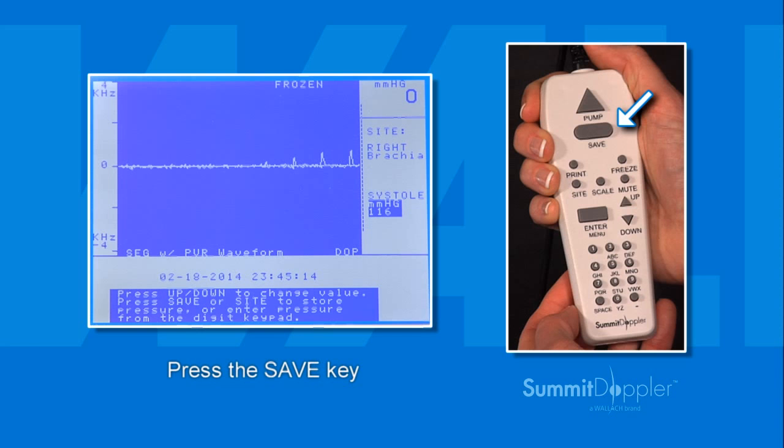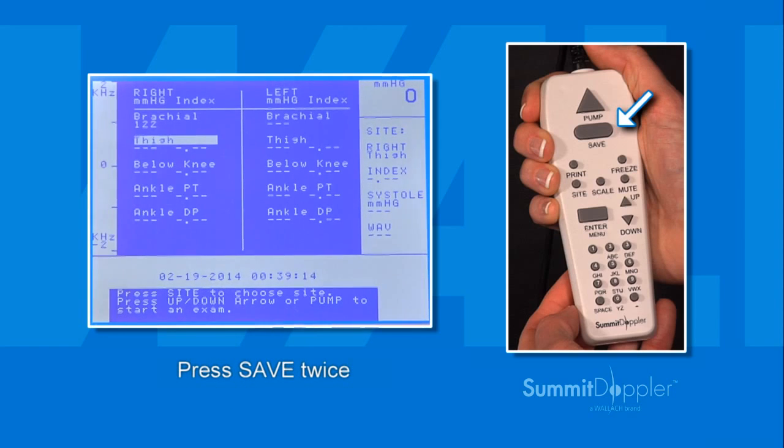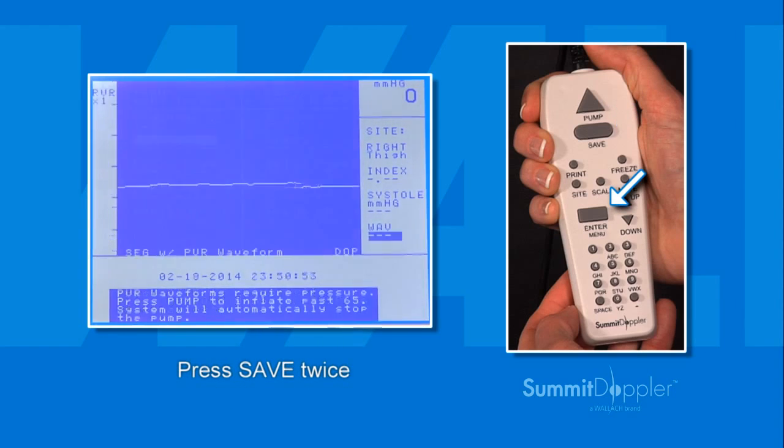If the pressure needs adjusting, use the up or down keys to move the caliper to the exact spot where pressure returned, or enter the desired number from the keypad. With the pressure recorded correctly, press save and then press the Enter menu key twice to proceed to the next site.